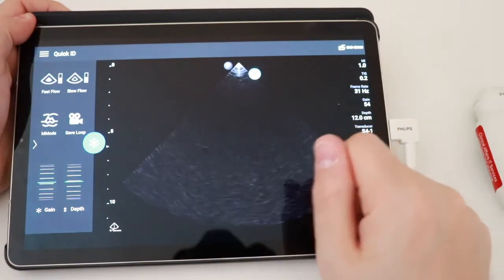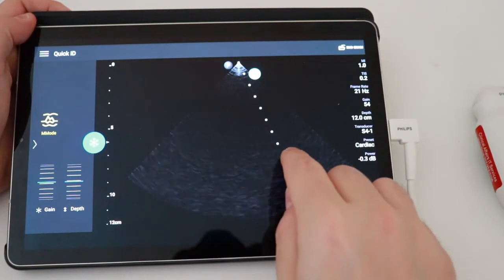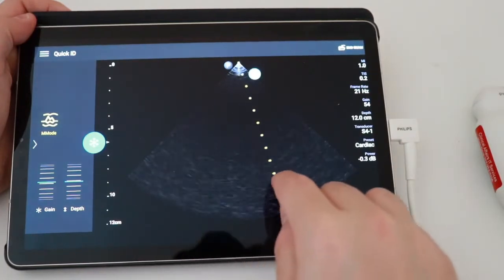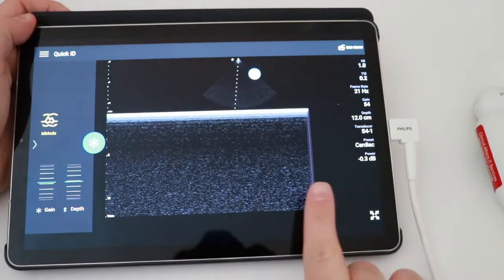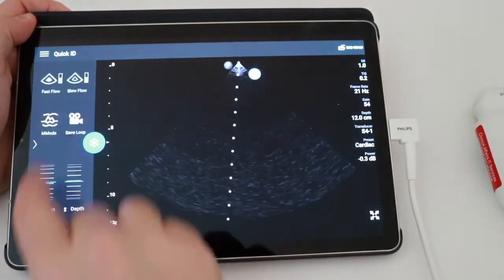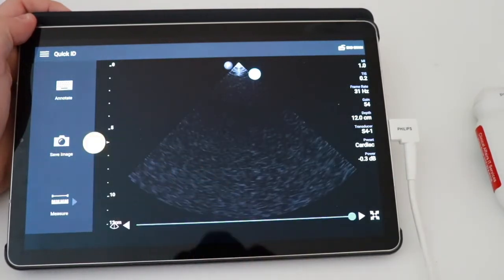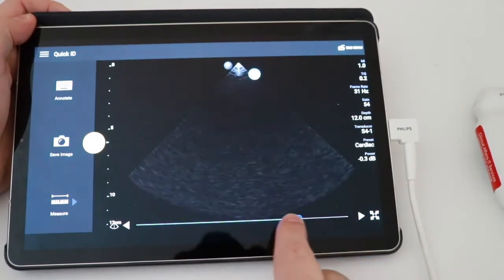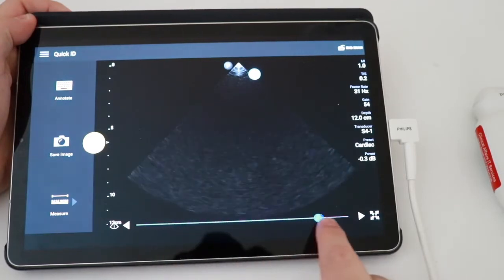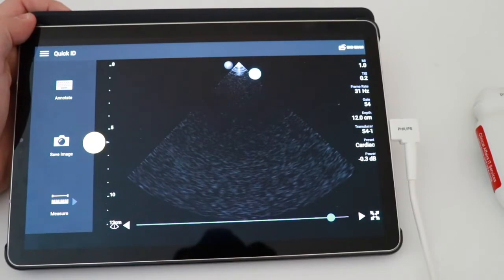We can change modes a little bit. We can go to M mode, which looks at a particular line over time. So if I move this line around, it'll show me this line in the y-axis over time in the x-axis. I can go back to my 2D mode. Anytime I want to do a still shot of an image, I can hit this freeze button. And I can actually scrub my previous images back and forth like this. So it actually has a moving cache of images that you can scrub back and forth if you want to go back and look at something that you just captured.